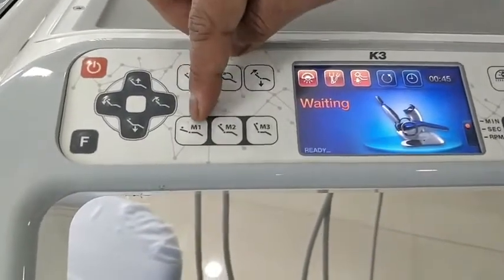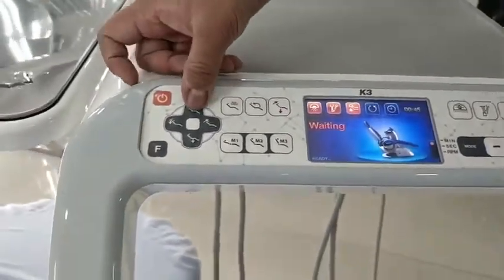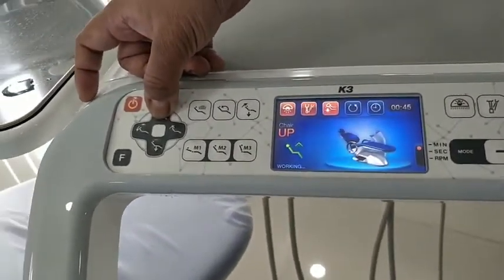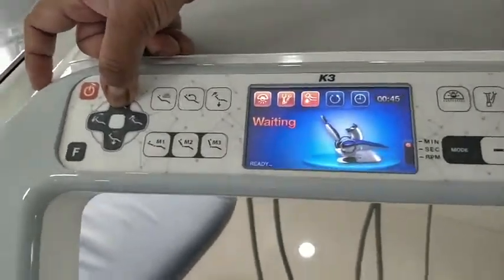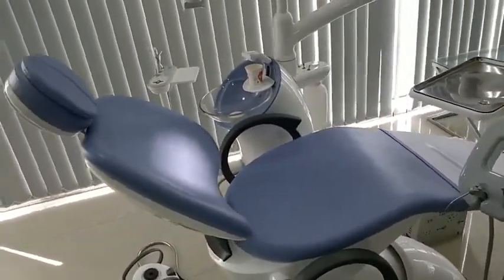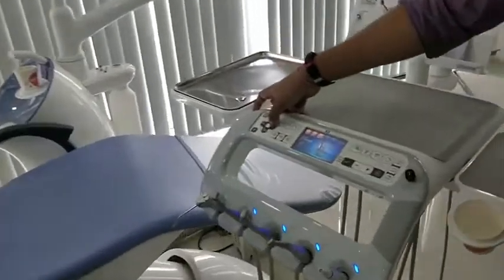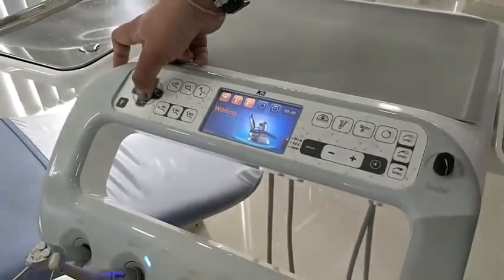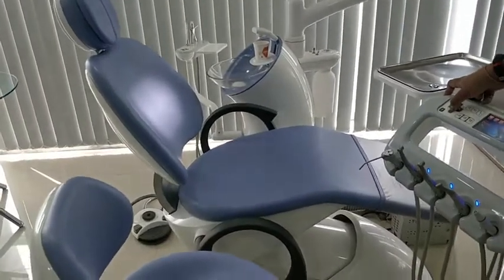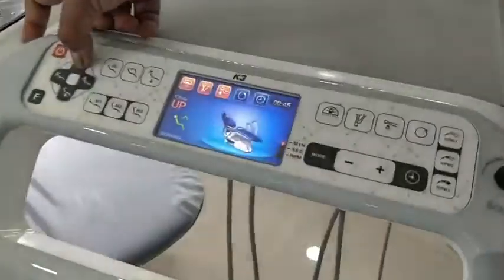Using the joystick, you can take the chair up and down. As the chair goes up or the backrest goes down, you can see the corresponding motion shown on the display panel. If the backrest is taken to an upright position, it shows 'upright' on screen. Whatever you do with the chair is visible on the LCD screen.